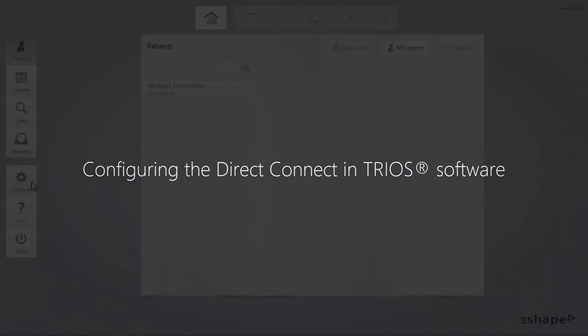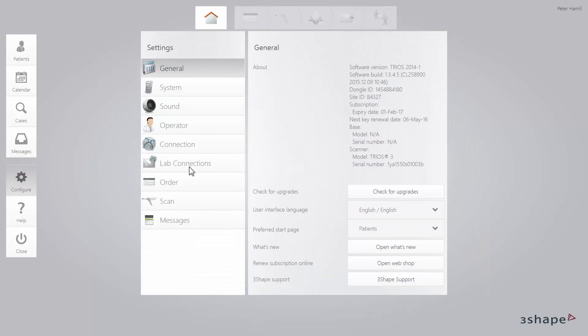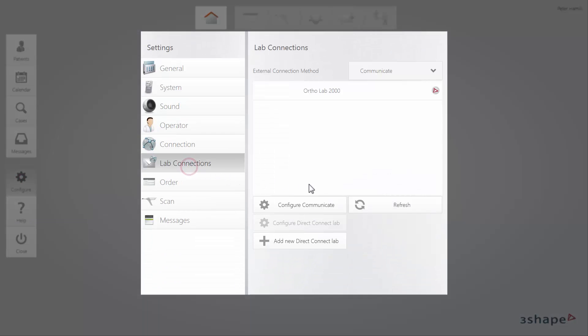Now you can go back to your TRIOS. While in TRIOS, you need to enter the Lab Connections menu. There you will find the necessary settings needed to integrate your work with TRIOS Direct Connect.